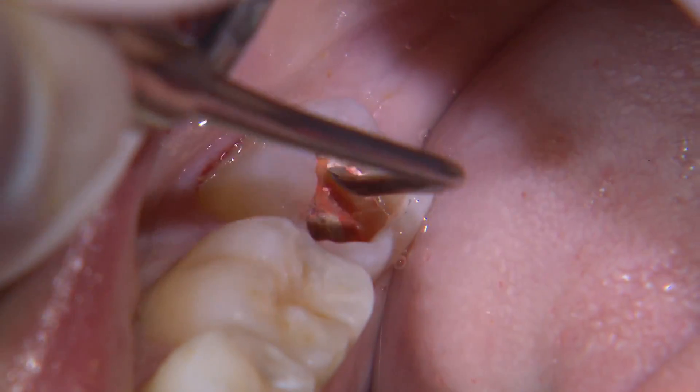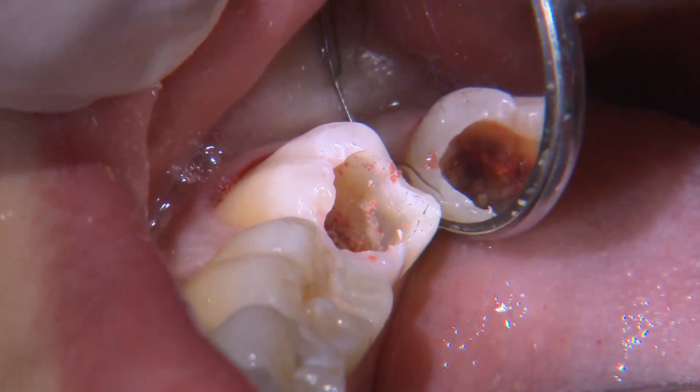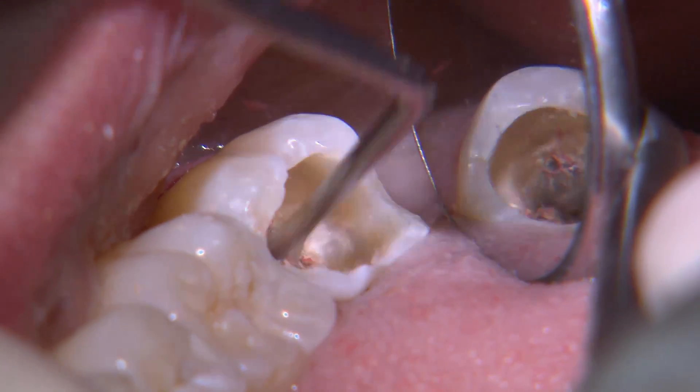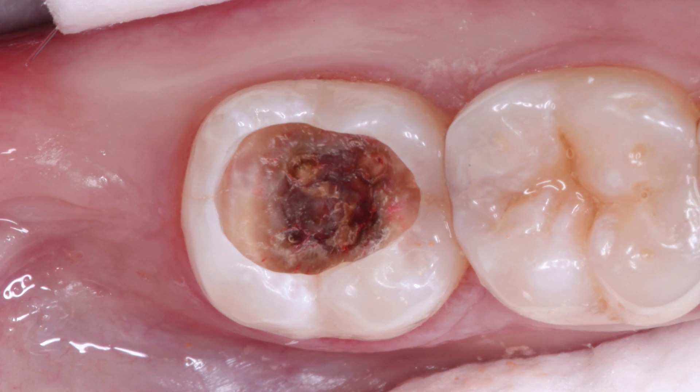I see that there's a crack line through the distal marginal ridge, but since there aren't any signs of leakage or decalcification, I like to bond directly to these areas. At a depth of about 4 millimeters from the occlusal surface, I do begin to see the pulp horns. It's best to leave any affected dentin to avoid pulpal irritation and further complications.